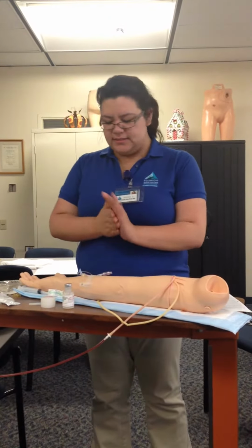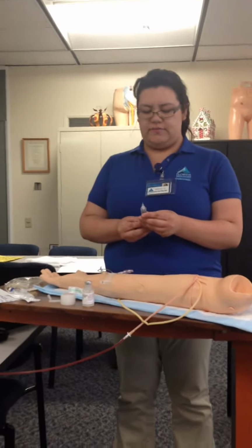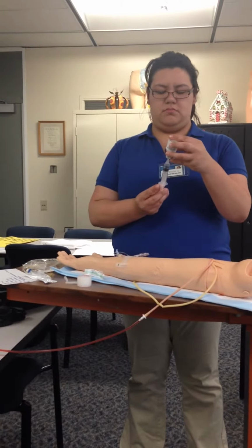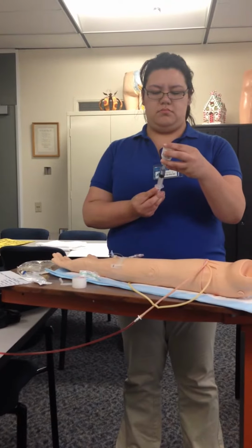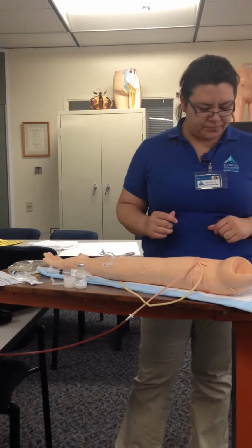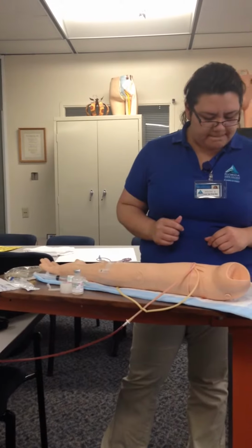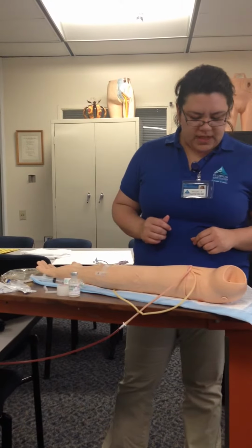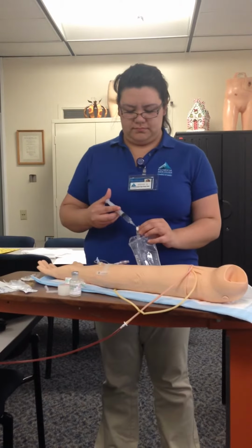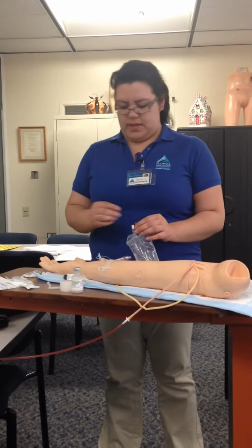First I would wash my hands and draw up 500 milligrams of my medication. Put that to the side. And I would add my medication to my bag. Put my blue cap back on.